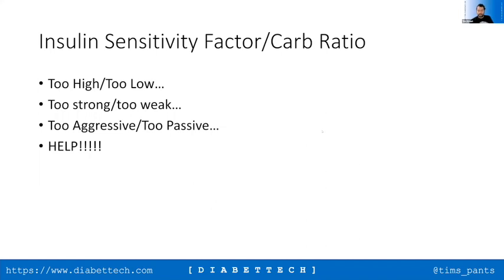And that's a good representation of why we have to be very careful to use the right terminology when we're talking about what these numbers mean. If you look at the results, we can see that 21% of respondents think that ISF is too weak means the number is too small. 72% think that the number is too high, and 8% aren't really sure what we're talking about here.